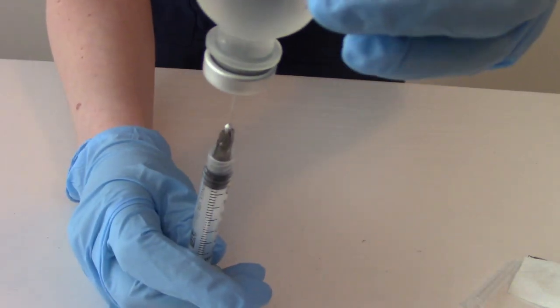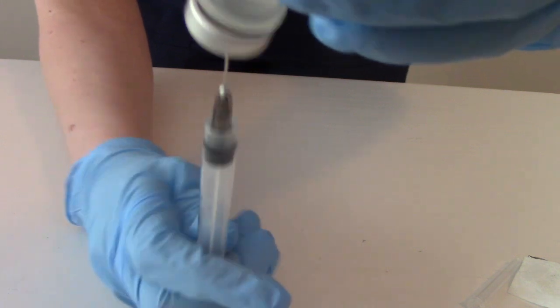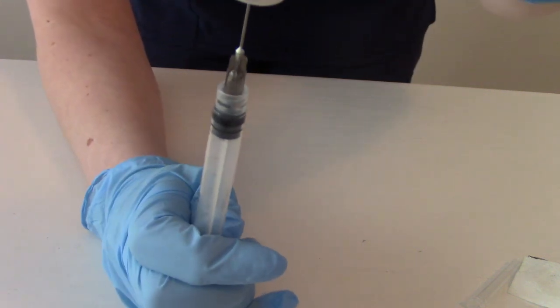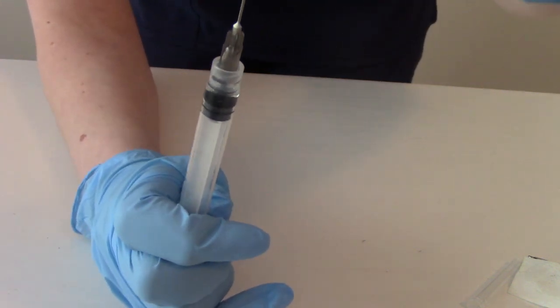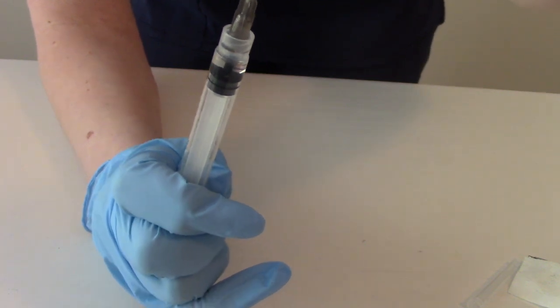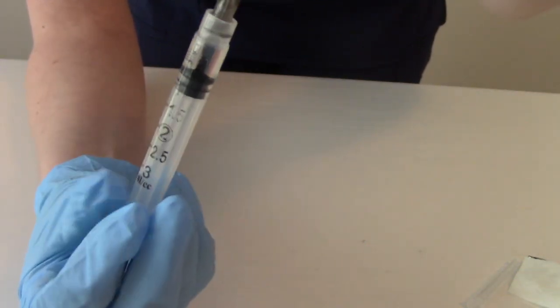We're going to invert it, so turn it upside down. And then we're going to pull back that same amount. So we injected 0.5 of air, we need to pull back 0.5 of the medication.